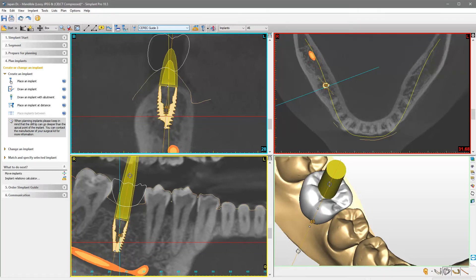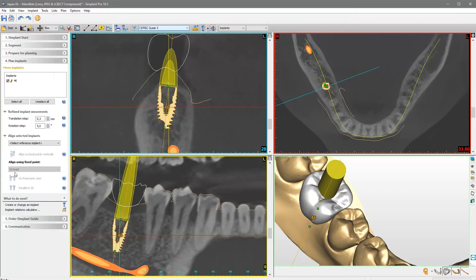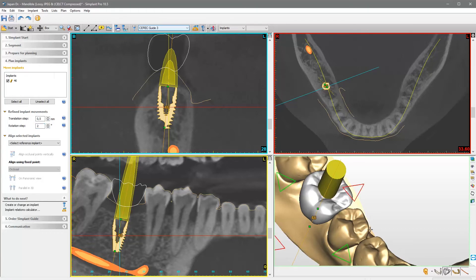If you want to have more accuracy in these adaptations, you can choose the Move Implants option in the task panel. Here, you can indicate the millimeters and degrees the implant will move or rotate with each use of the movement controls. As soon as you move the mouse to one of the views, a set of movement controls — arrowheads and rotation controls — arrowed circles, will appear.